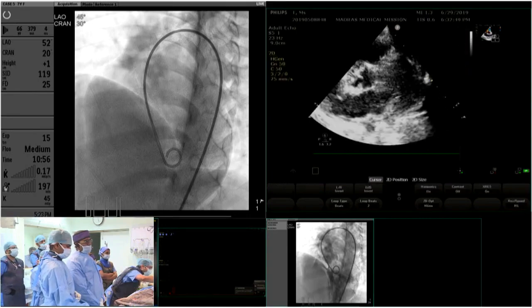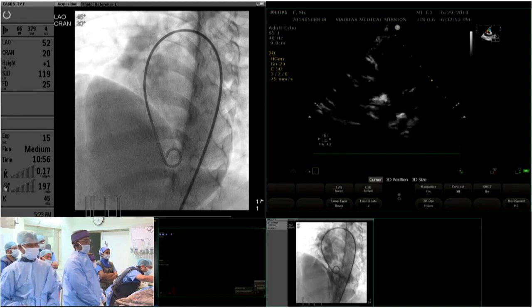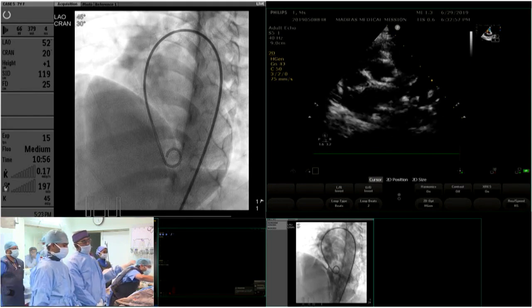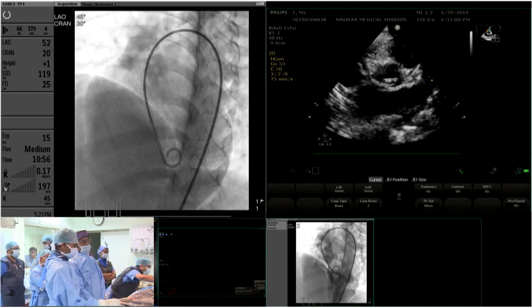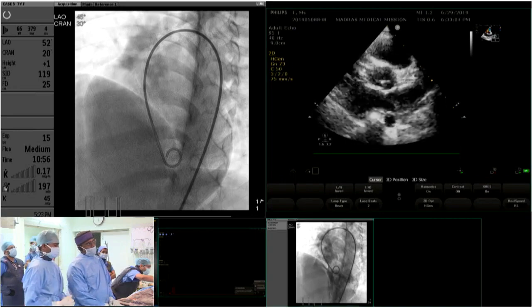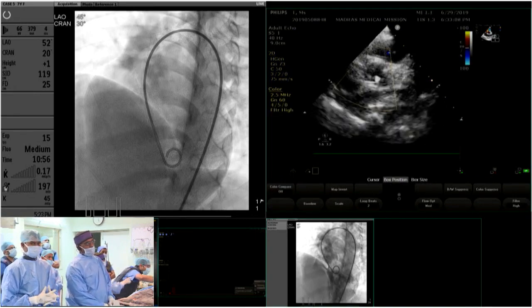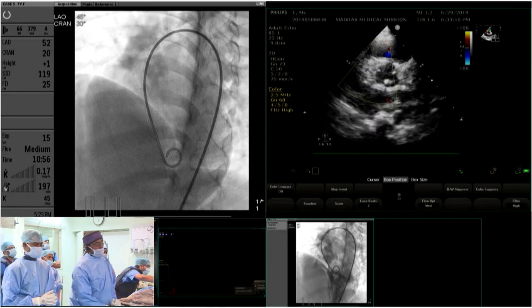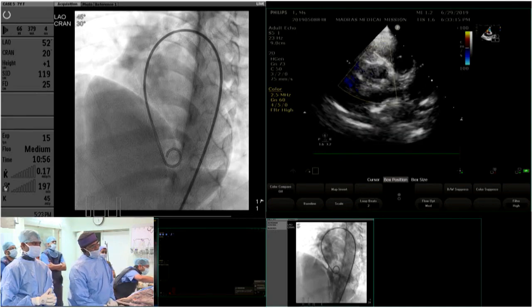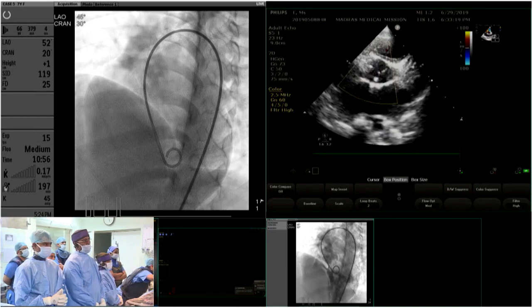Jesse, do you feel we have all the information? We need some more. What else do you need? Siva, would you be using transesophageal or transthoracic? The normal practice for us in our cath lab is to use only transthoracic echocardiography with sedation using a combination of ketamine and midazolam, and we don't employ transesophageal echocardiogram usually in our perimembranous VSD device closures at all.